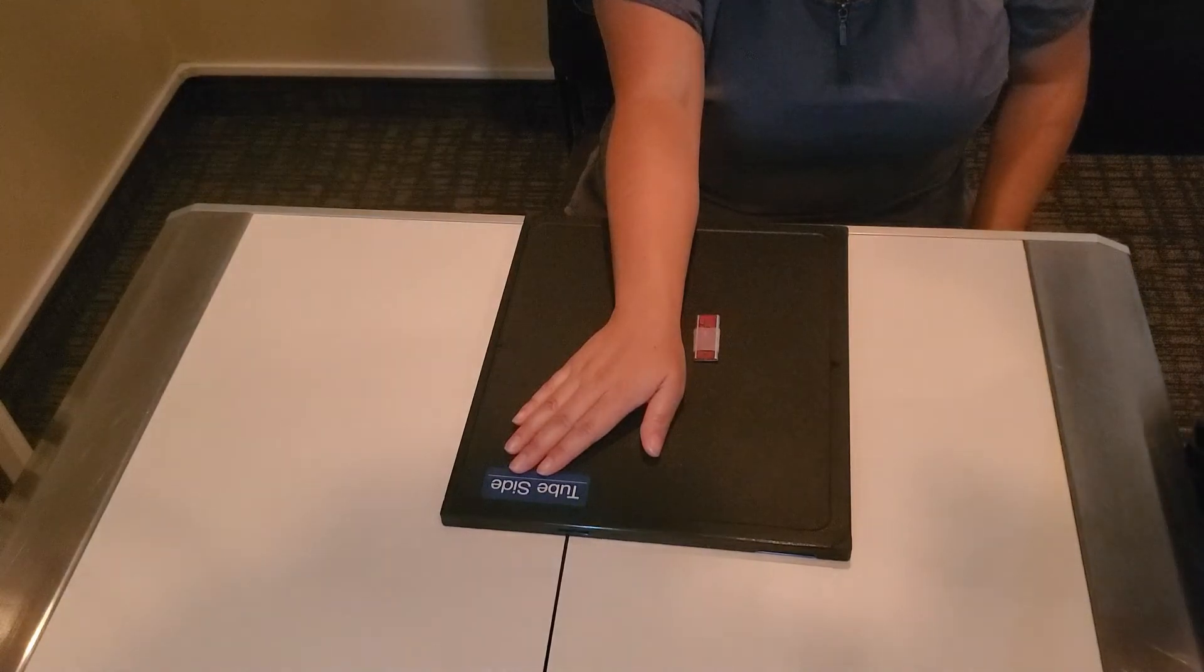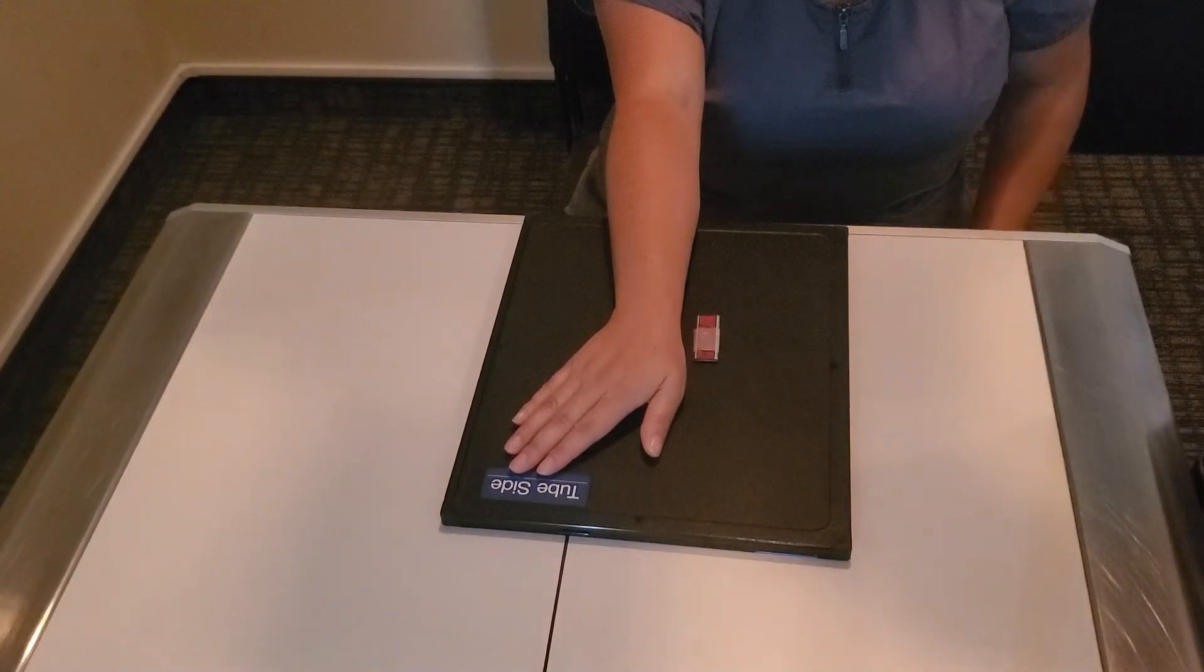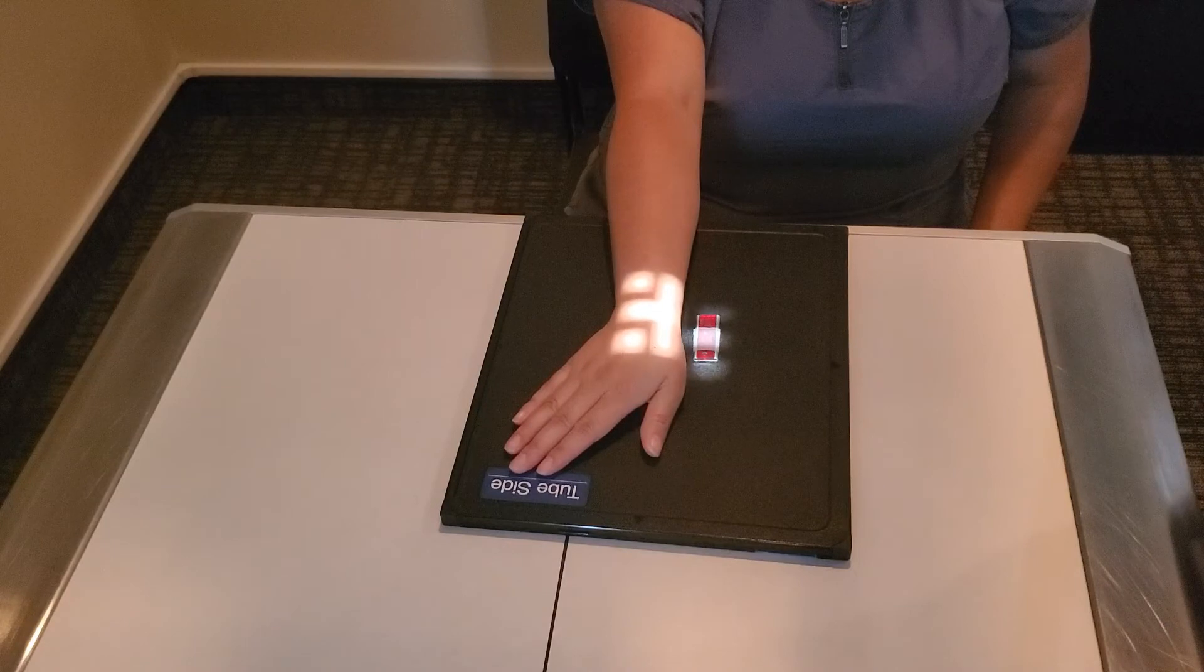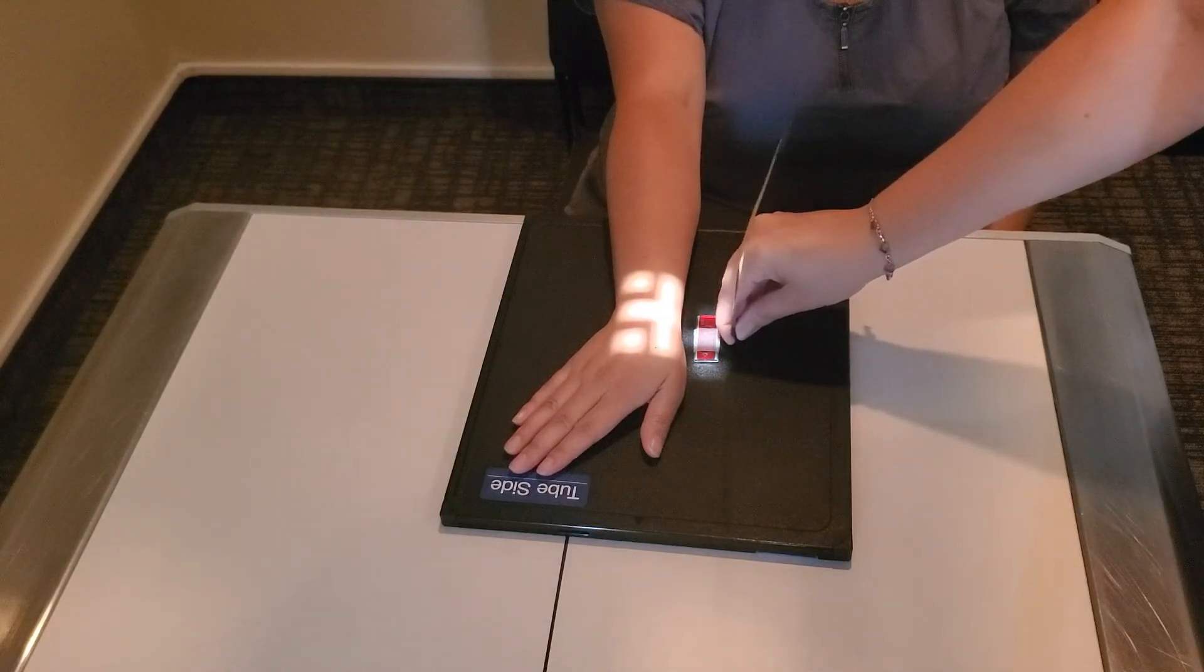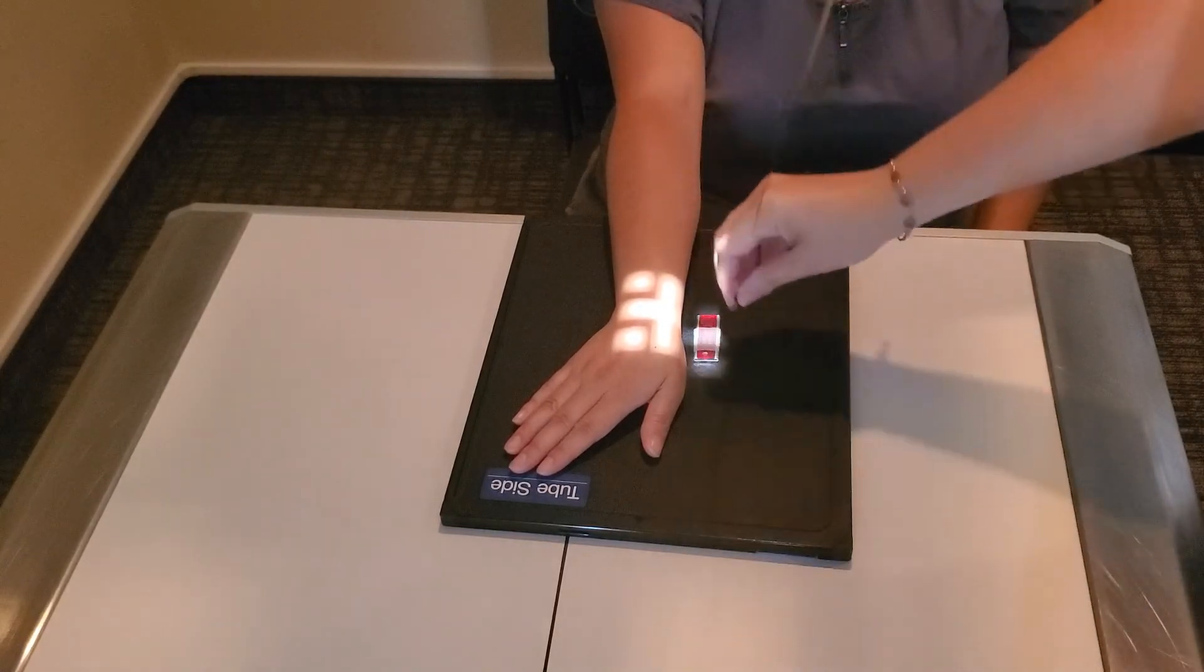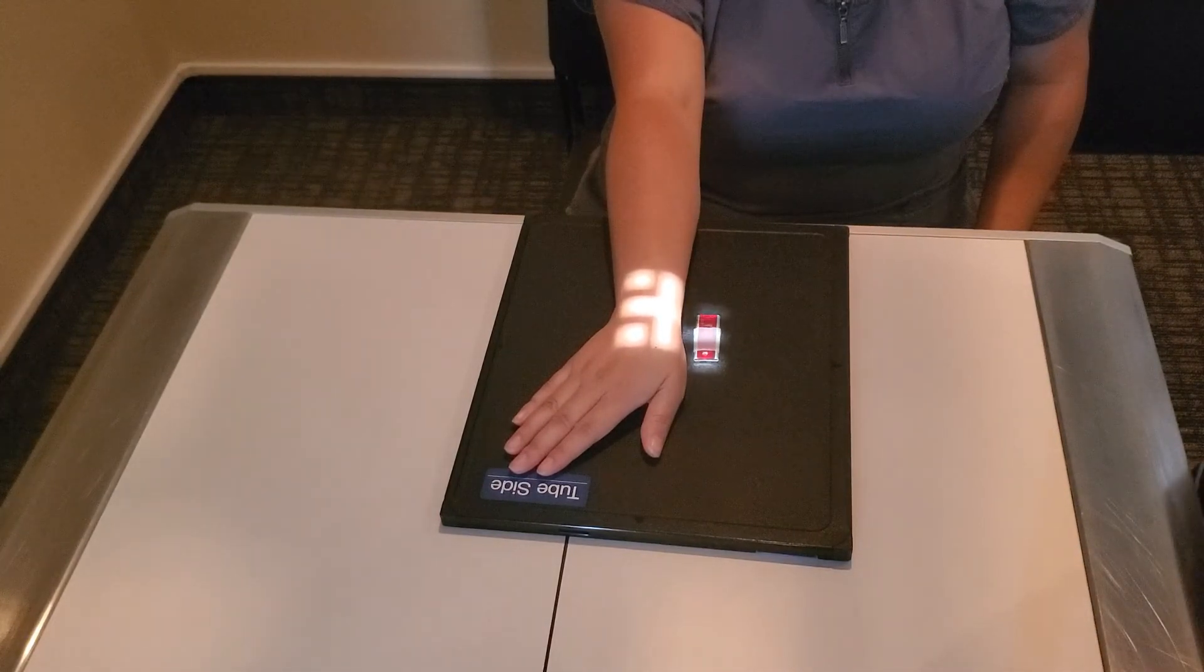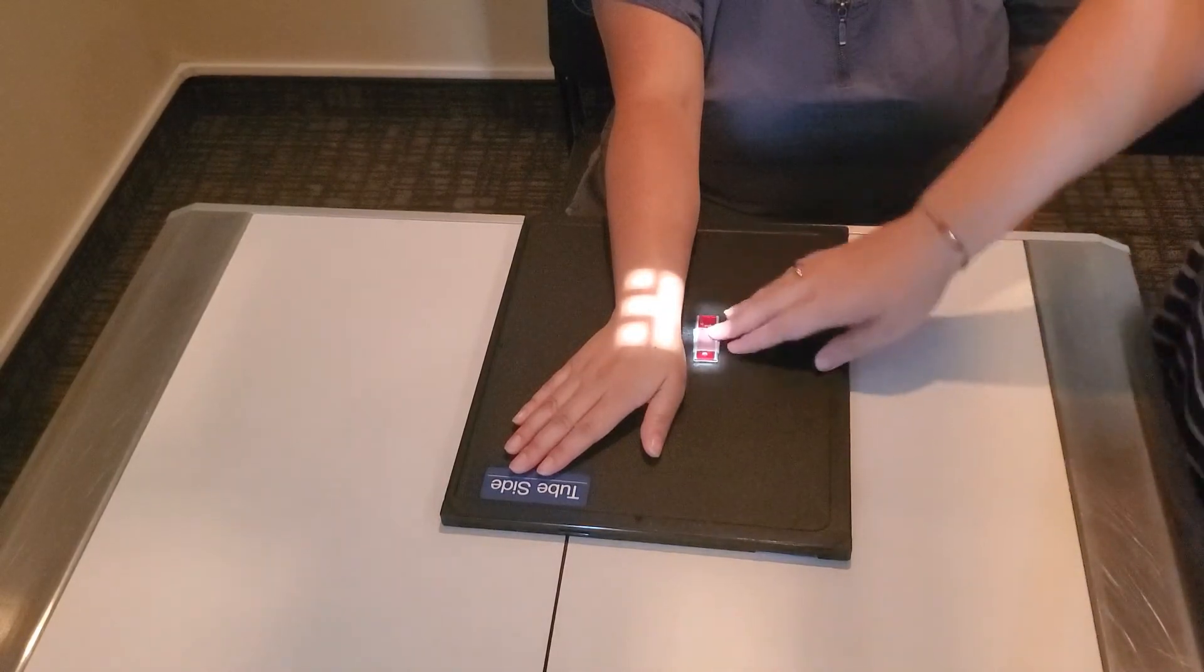So we'll rotate the 20 degrees for our collimator head. And we're still going to center to the scaphoid. And you're going to use your measuring tape and measure specifically to that landmark. Right now I'm a little long so I'm going to come down and in. And that's going to get us closer to our 40 degree or 40 SID.